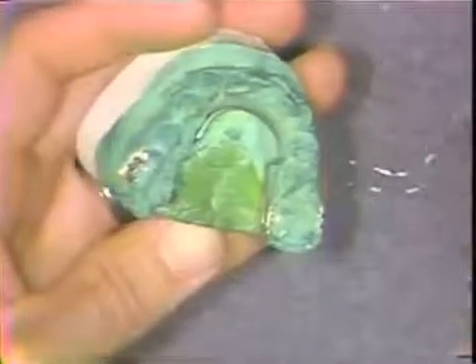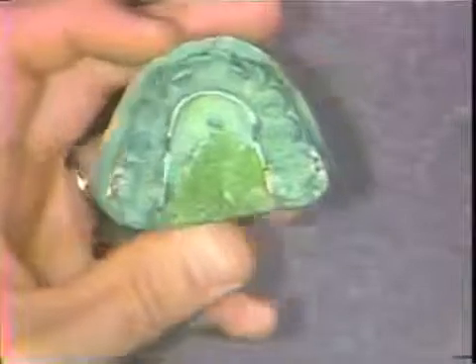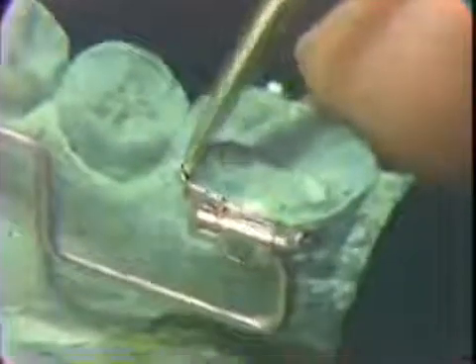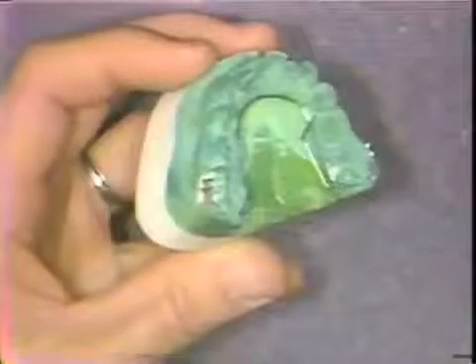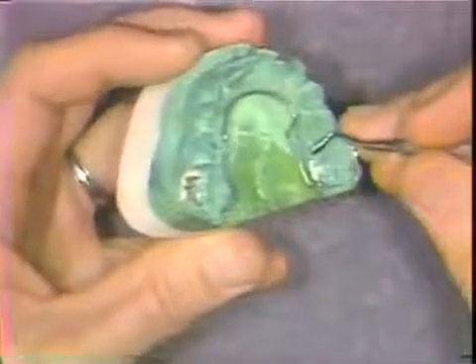The end of the twist is cut with 4 or 5 millimeters of excess left so the cut end can be tucked well out of the way. A serrated amalgam plugger is used, and the end is tucked beneath the lingual sheath.